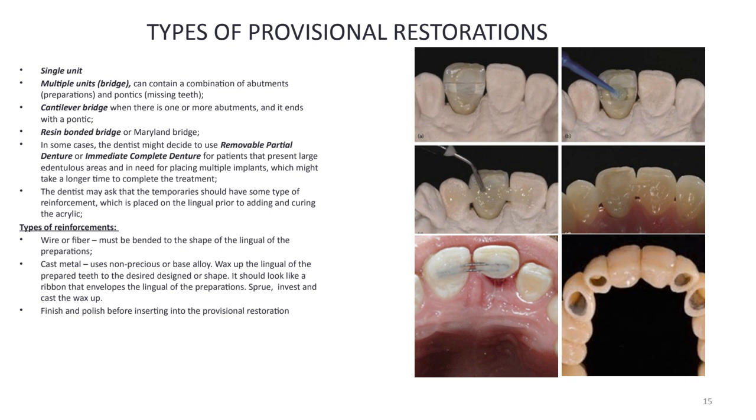The main idea of the provisional restoration is, first of all, to give a little bit of oral function and aesthetics to the patient, but also the most important aspect is to protect the implant site.